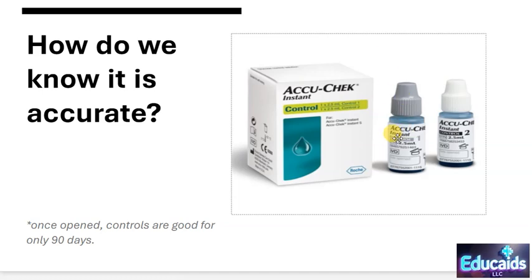So for example, the level 1 would be a low blood sugar reading, or a low amount of glucose. When I do that test, I would expect the machine to read 60 or under, and then I know it's reading accurately. Then I would also do the high control. I would expect that to be a higher reading. Generally on the label, it will tell you the ranges that this should read.